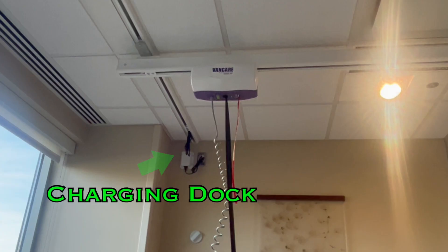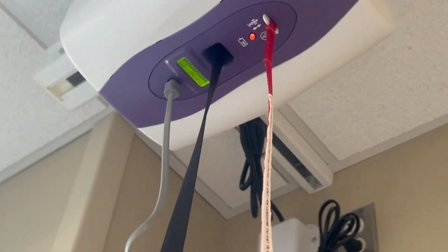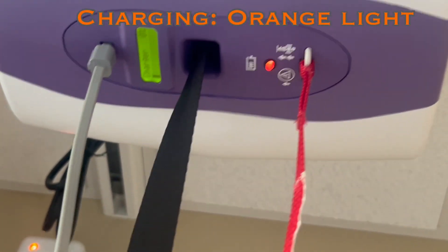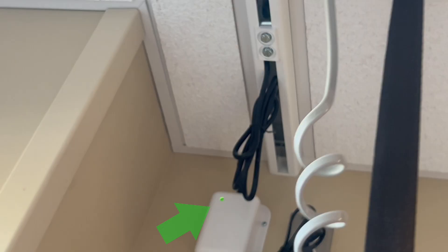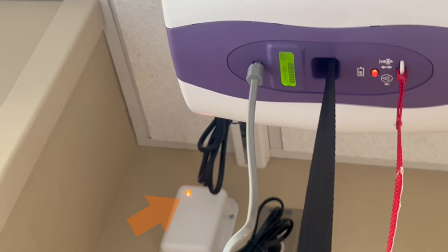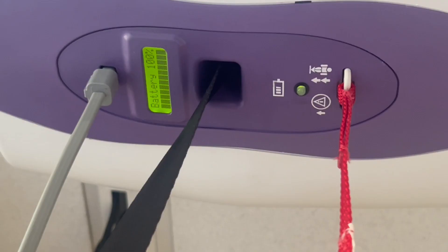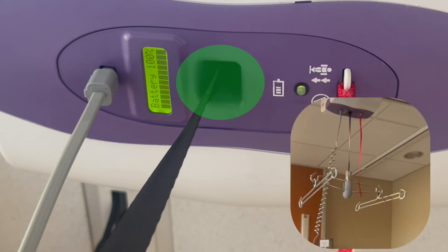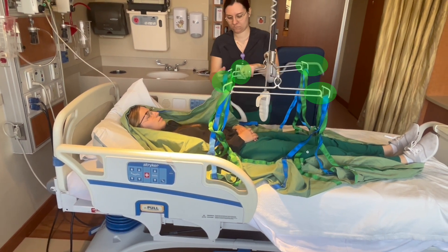The charger can be found in the back corner of the lift track near the window. To dock the lift, simply pull it back to the corner and it will click into place. When it's properly docked, the indicator light will switch to a light orange. The charging unit on the wall also has a green indicator when the lift is not docked, and changes to orange when the lift is docked. Always keep the lift docked when not in use. In the center of the lift is a black strap that connects to an H-shaped bracket, which connects to the sling, with locking hooks on the four corners of the bracket.